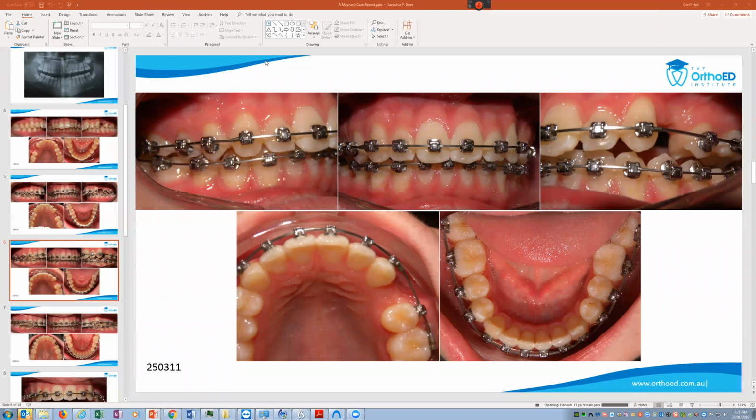Oh, okay. So is that also why sometimes people put coloured elastics over self-ligation brackets, just to jolly along the kids, or is it actually useful for something? No, it's not useful at all. It's purely to jolly along the kids.